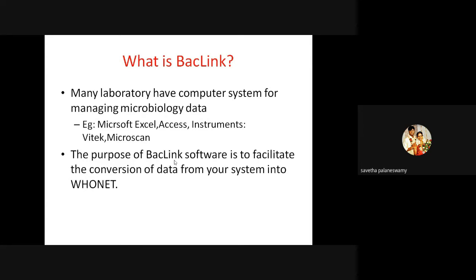WHONET is the proper software with which we can do antimicrobial surveillance. So how are you going to convert your original data into WHONET? Are you going to sit and type it manually? No. WHONET has given a wonderful software to convert your present data into WHONET data. For that purpose, BacLink will work very well.